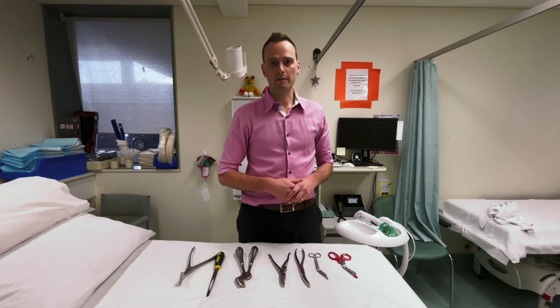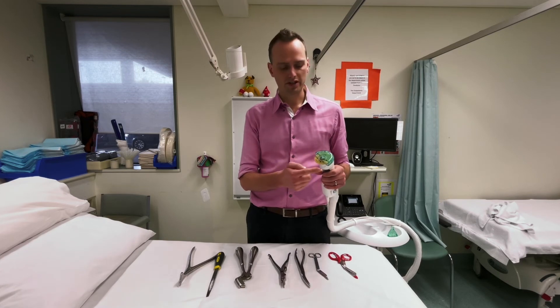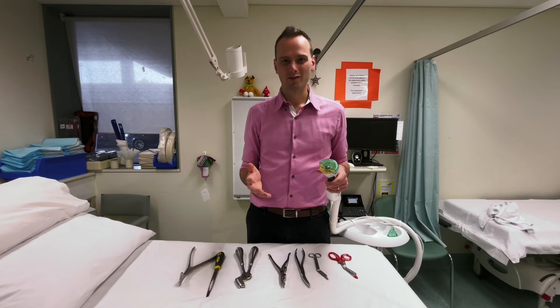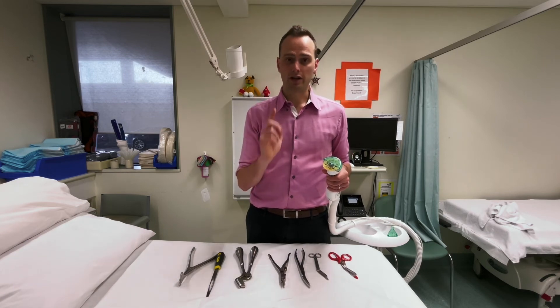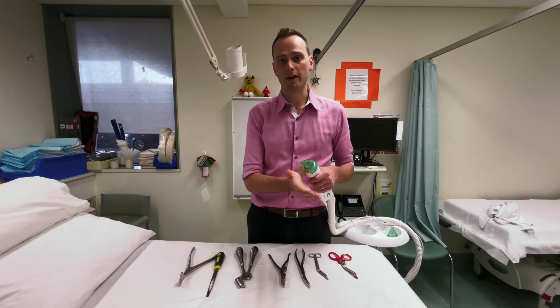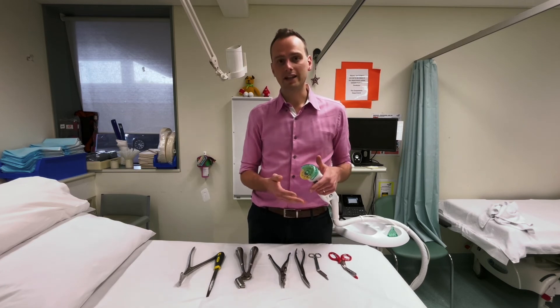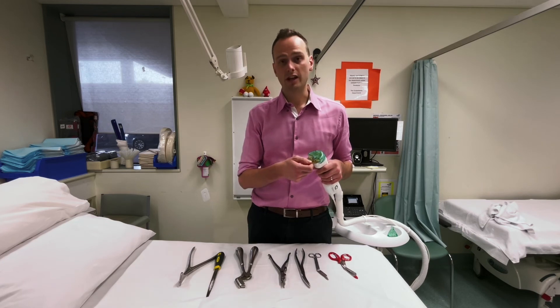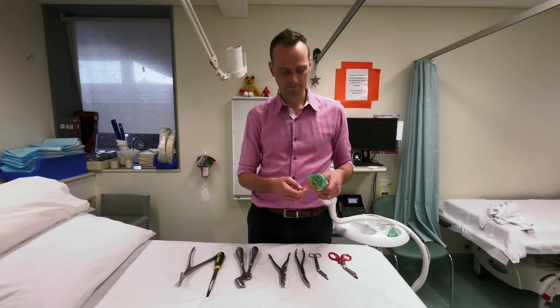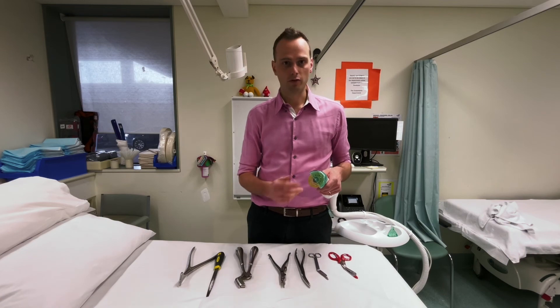The plaster saw is the workhorse of cast removal. Many used in emergency won't have a vacuum attached. A key thing I explain to patients is that it's not a circular saw — it just vibrates very quickly backwards and forwards. I actually find it reassuring for patients if I turn it on and gently touch it on the pad of my thumb to show them it's not going to cut skin. Obviously if you push hard enough through all the padding it can cut skin, but the blade parts typically get caught in the padding. It can also get very hot — watch the removal videos linked below for more information.